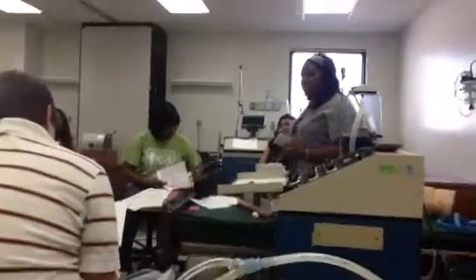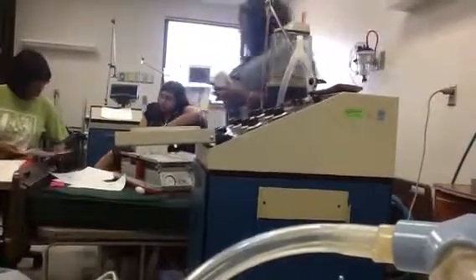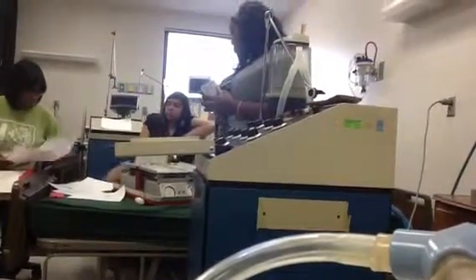What'd you say was low volume alarm? That's 100 below. So push this up and down. It reached up to 500, so it'd be 400. That's for y'all calculations. To help y'all practice. But y'all probably want to do it.